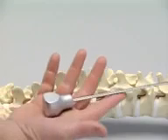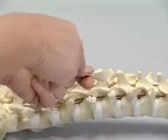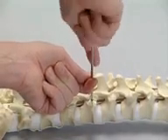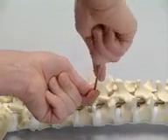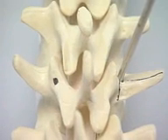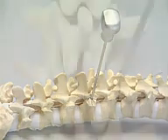Hold the head of the pedicle probe in the palm of the hand. Use both hands as shown for maximum safety. The pedicle probe is used to drill as far as the anterior cortex of the vertebral body. In the lumbar spine, there is no requirement for cephalad or caudal tilt in the sagittal plane.